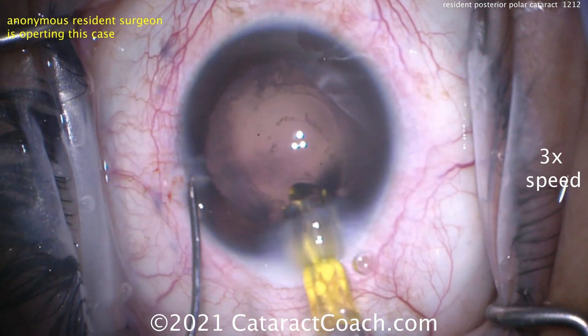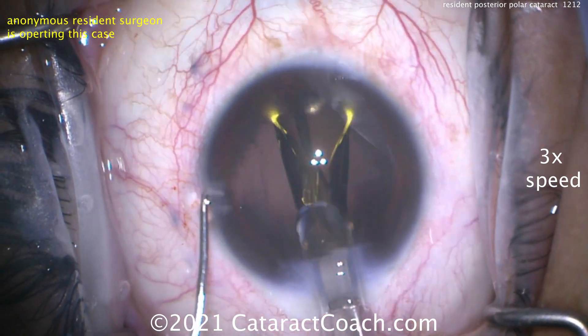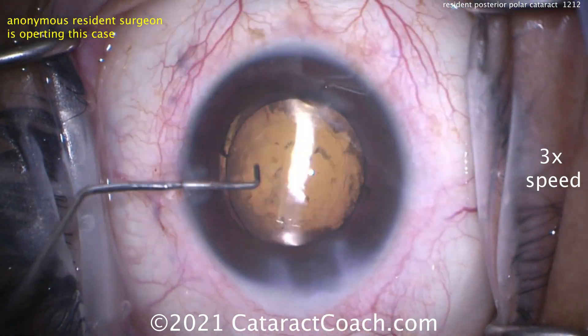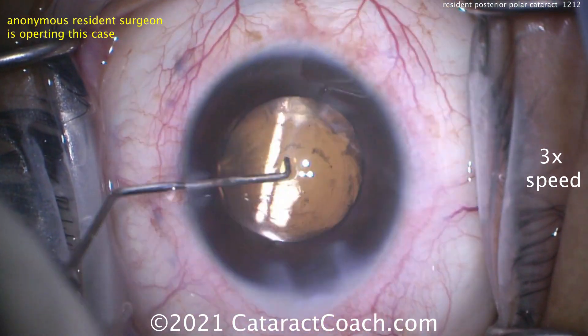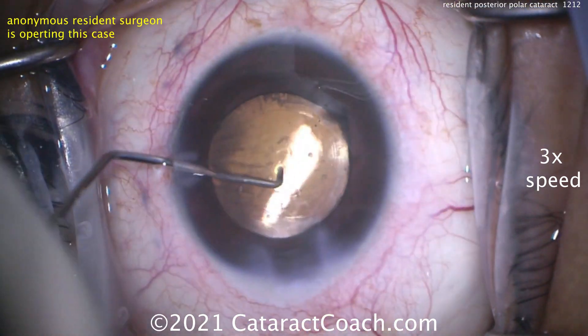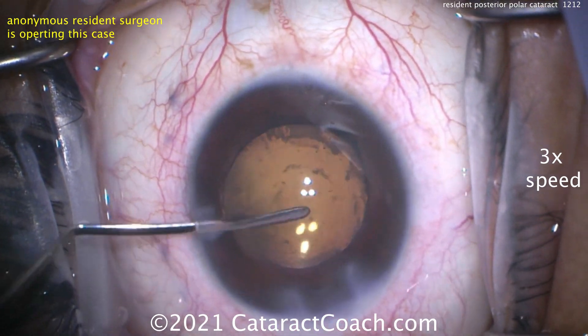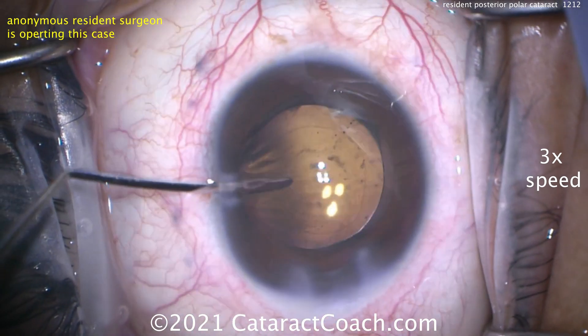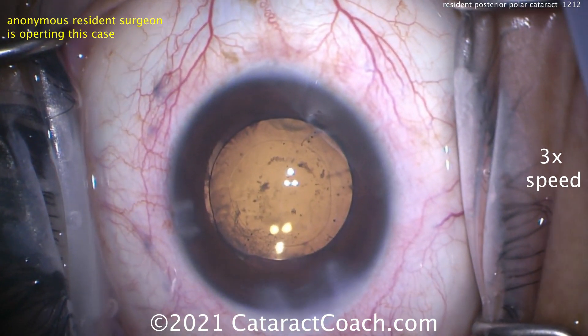Did you notice the marks on the cornea? This patient needs a toric lens — about 3 diopters of corneal astigmatism — and we want to address that. If you break the capsule, so much for your toric lens. In the US, there are no toric lenses that are FDA approved for sulcus placement. There's the lens going in — notice how as it was delivered, the lens just snuck under that nasal capsulorhexis edge and did not touch the posterior capsule at all.